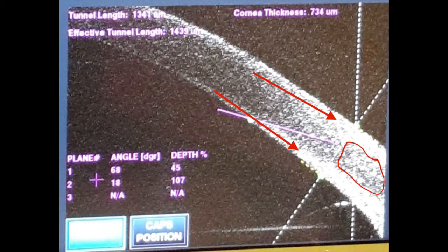This illustration documents some of the things I look for in the position of the corneal incision. The red arrows point to likely areas of arcus senilis, and the pathophysiology of arcus senilis is that it can occur in the anterior and posterior areas of the cornea, but it typically spares the central portion of the cornea.